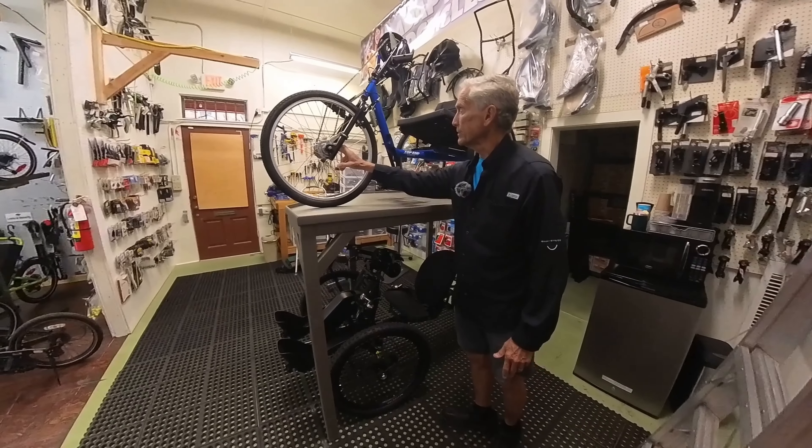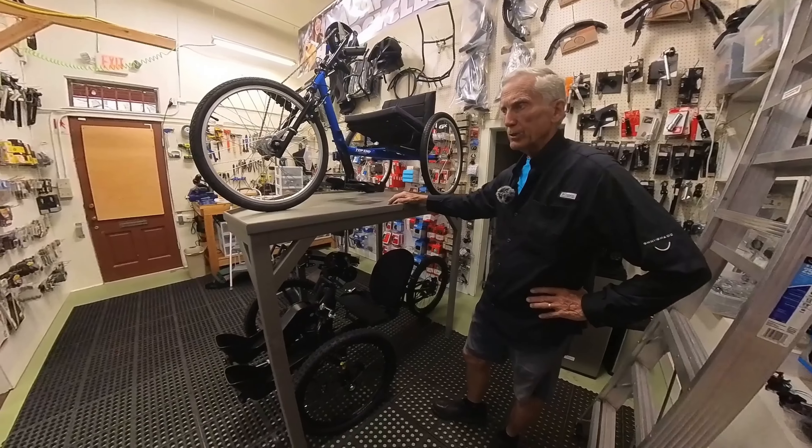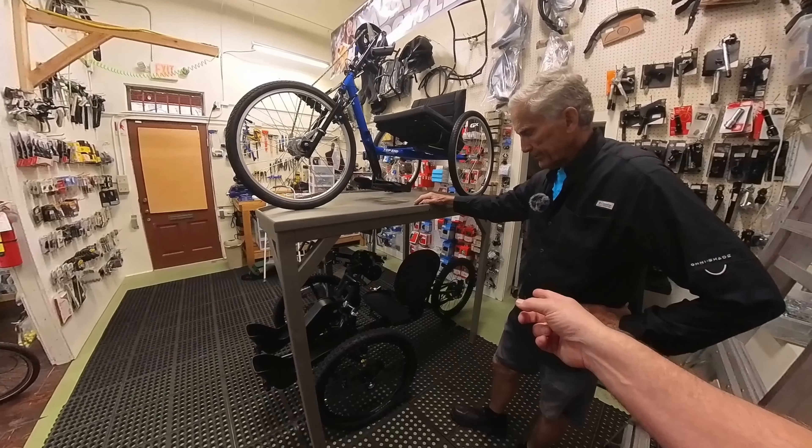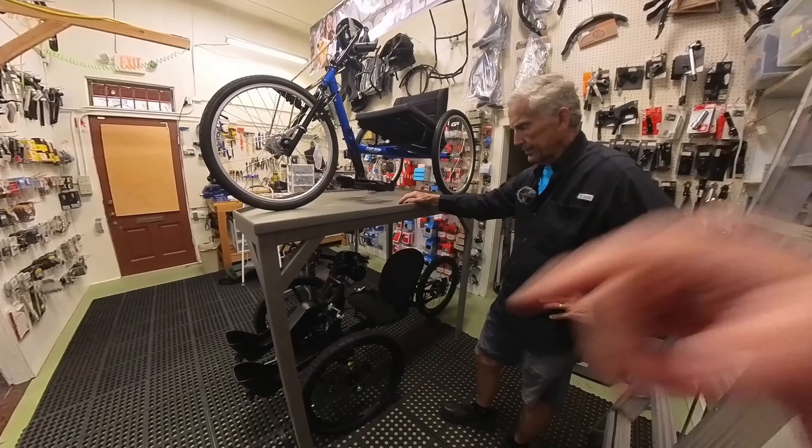It's got an internal hub for shifting. But it's amazing how well this goes. Now, this is the same thing except it's a trike base — more of a delta or a tadpole.